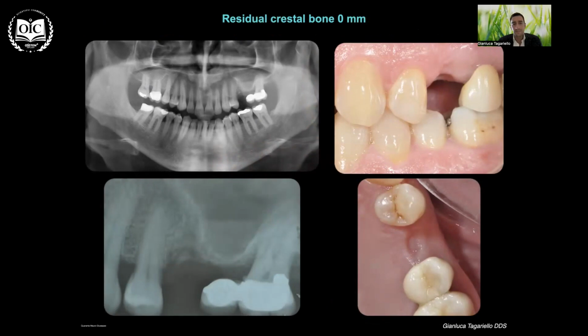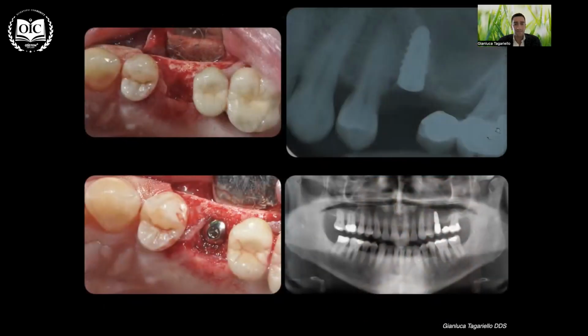This is a very nice treatment. The patient came to our office for implant insertion in the 2.5 area, and we could help him. But after the period of healing, after the rehabilitation, he came again to our office because we wanted to put another implant in the 2.6 area. But the problem is that the distal part of the implant that we had inserted in the past has contact with the membrane of the patient. So the detachment of this membrane can be very challenging.